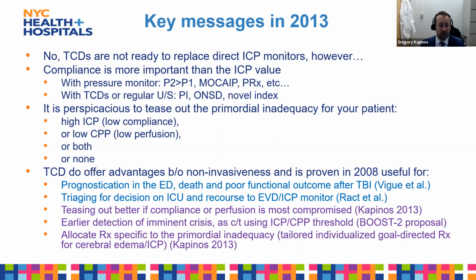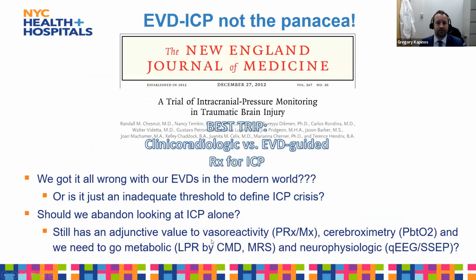What is wrong with my patient? My patient in bed 1 at 3 p.m. has more of an issue with his ICP going up, but the same patient 3 hours later might have an issue more with his CPP being too low. So which one should I try to address? And of course, our armamentarium of treatment is different and can address the primordial issue.